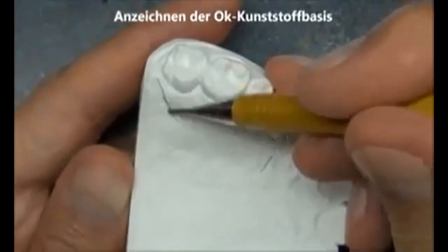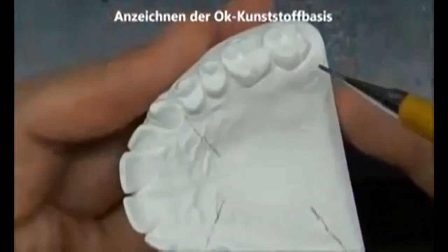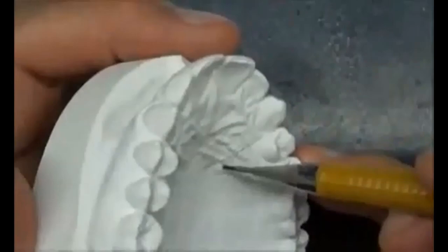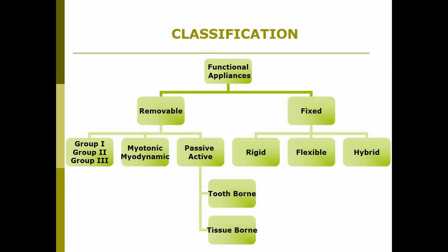Okay, so here whichever appliance we have chosen, we are making the required wire components which will be required, plan the design, and then make the appliance with this construction bite on. So there are various types of functional appliances which we can give. They can be removable, fixed, and there are further categories of each. So I'll give you a video of each so that you get an idea what comes in each category.